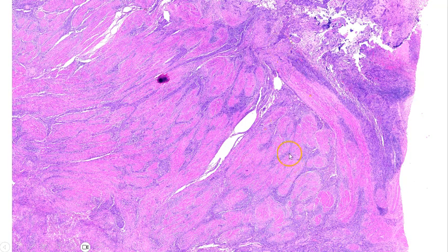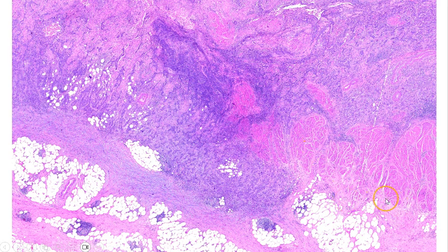Here is a low magnification picture showing the tumor islands invading into the lamina propria and into the muscularis propria. And here, to recap, is the deep edge of the muscularis propria, and we can see that the tumor has gone beyond this into the perivesical fat.